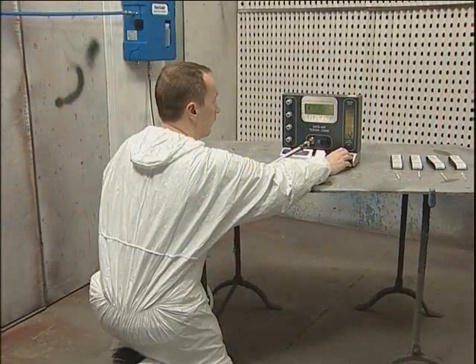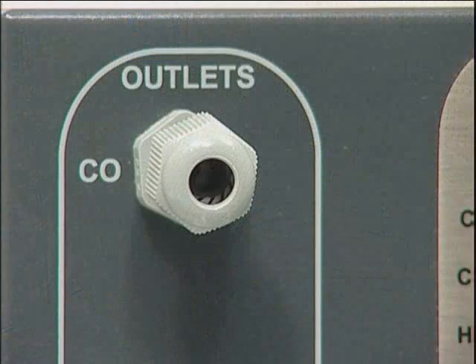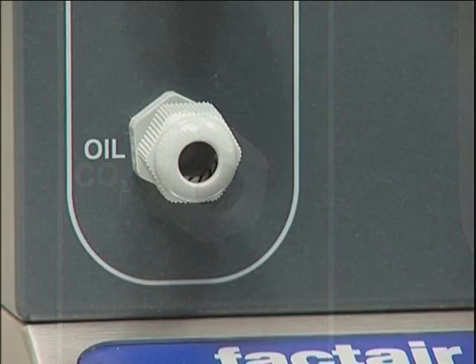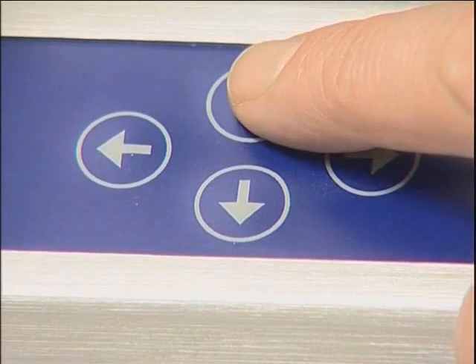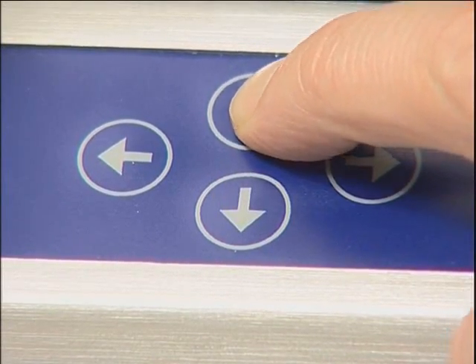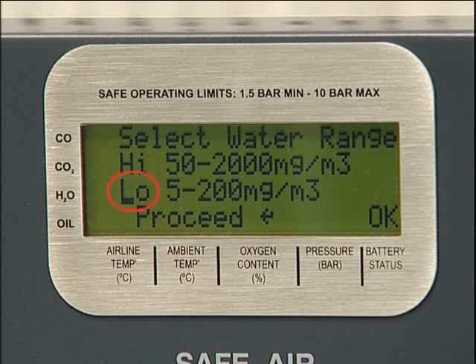If the flow, pressure and odour tests are satisfactory, press enter to carry out the tube tests. All flow rates through the tube ports are set, as is the duration of flow through both the carbon monoxide and carbon dioxide ports. Duration of flow through the oil channel and water channel is variable and must be set. Select the water range by means of the up and down scroll buttons. High range is for use on standard airline systems with a fridge dryer or no dryer, and low range is for high pressure cylinders and low pressure systems incorporating desiccant dryers.